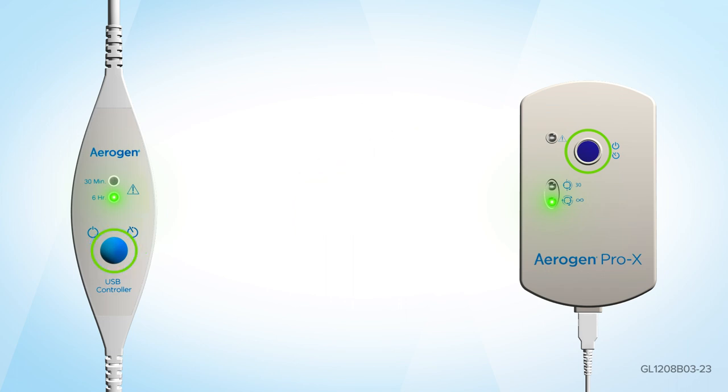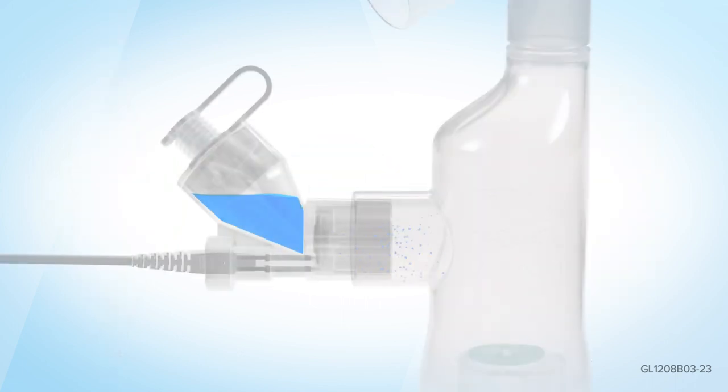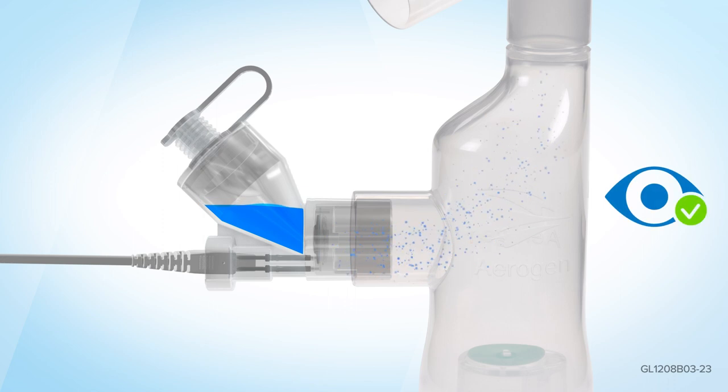Please note: to use the Aerogen Pro-X controller in continuous mode, you will need to be attached to the mains power supply. Visually check that aerosol is being produced.